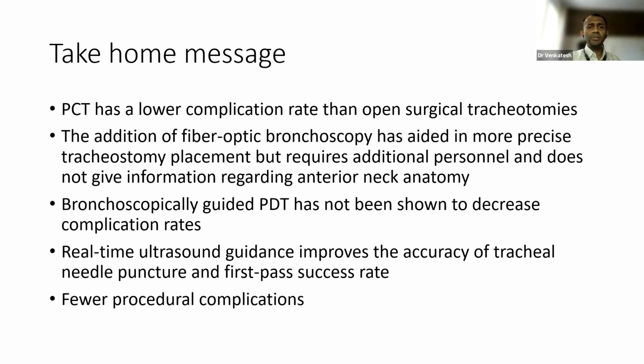Fewer procedural complications. There are even studies where a 2-hour workshop on a tracheal model has helped many trainees to get adequate skills to perform tracheostomy. It is also recommended that at least 20 procedures should be performed with the help of guidance before. Roughly around 20 procedures is the time of mastery that you need to acquire the skills.